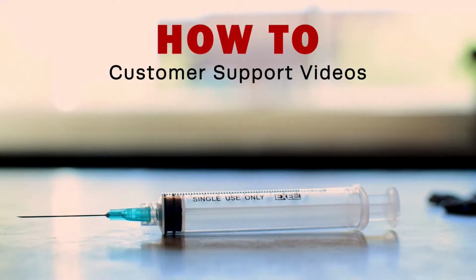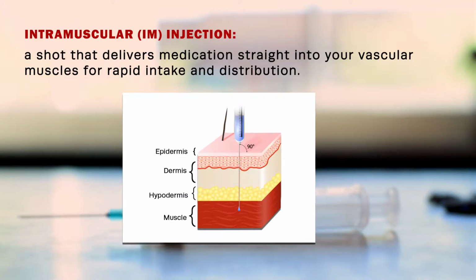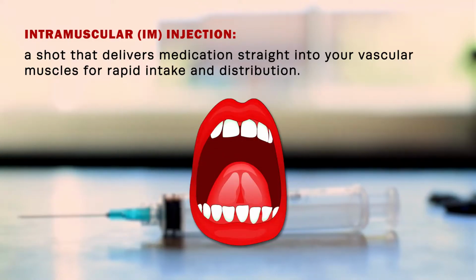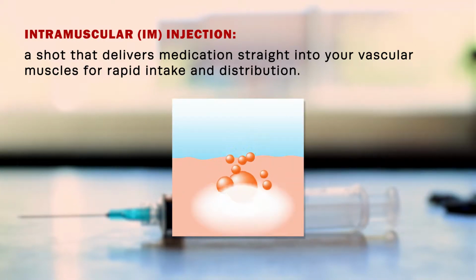In this video, we will provide a step-by-step guide on how to self-administer an intramuscular injection. An IM, or intramuscular, injection is a shot that delivers medication straight into your vascular muscles, allowing them to take faster effect than sublingual, digestive, or even skin-absorptive delivery.